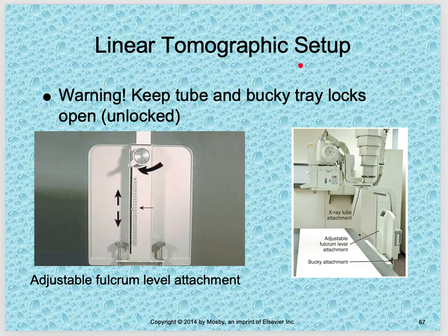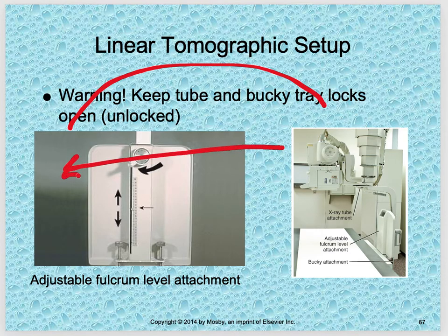So linear tomographic setup, warning: keep the tube and bucky tray locks open. These locks need to be open so as the tube travels this way, your cassette, your bucky is traveling this way. If those locks are locked, it's not going to allow that image to be made, and it may damage the equipment.